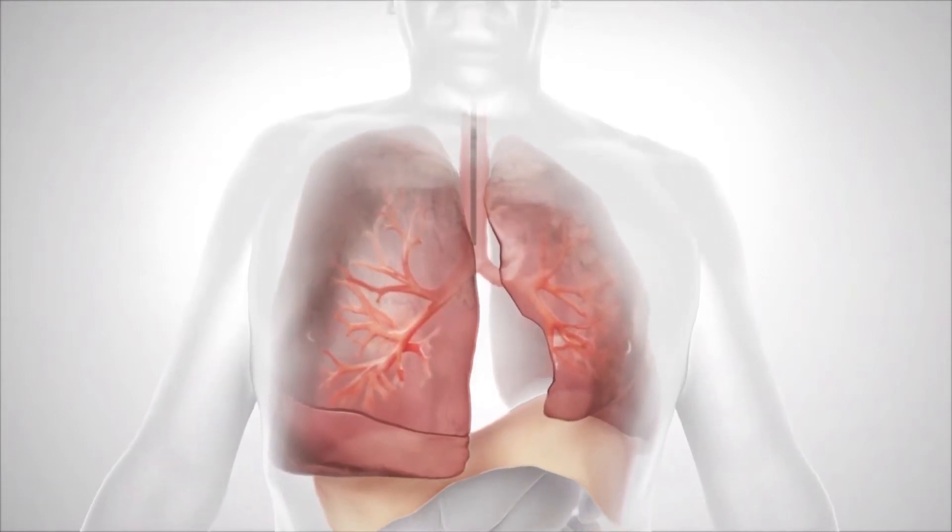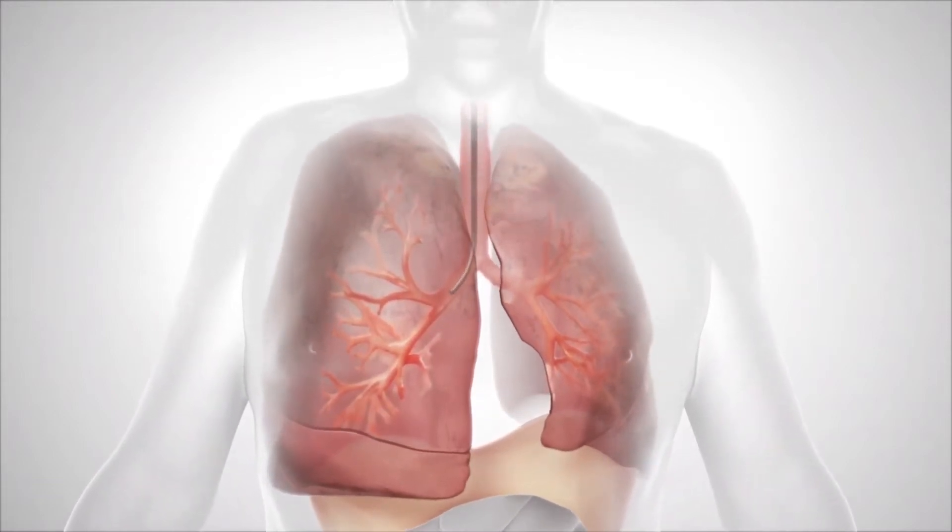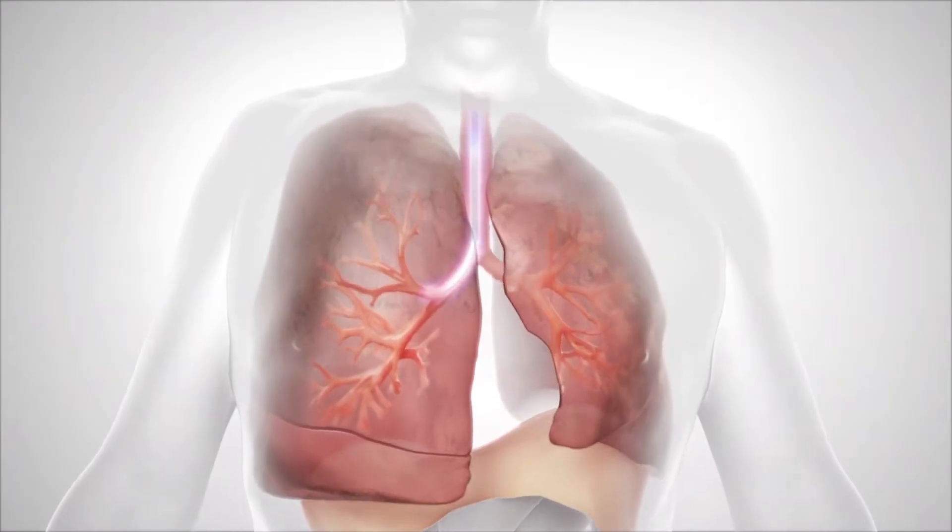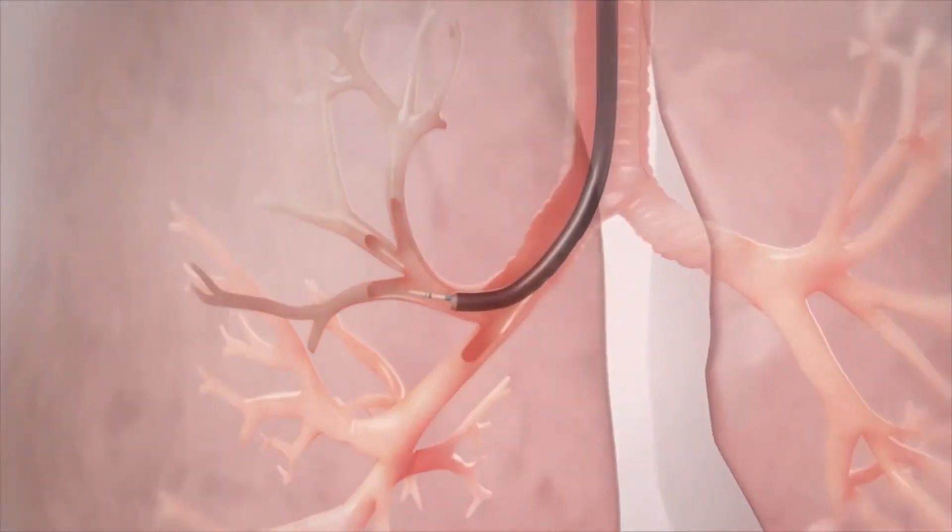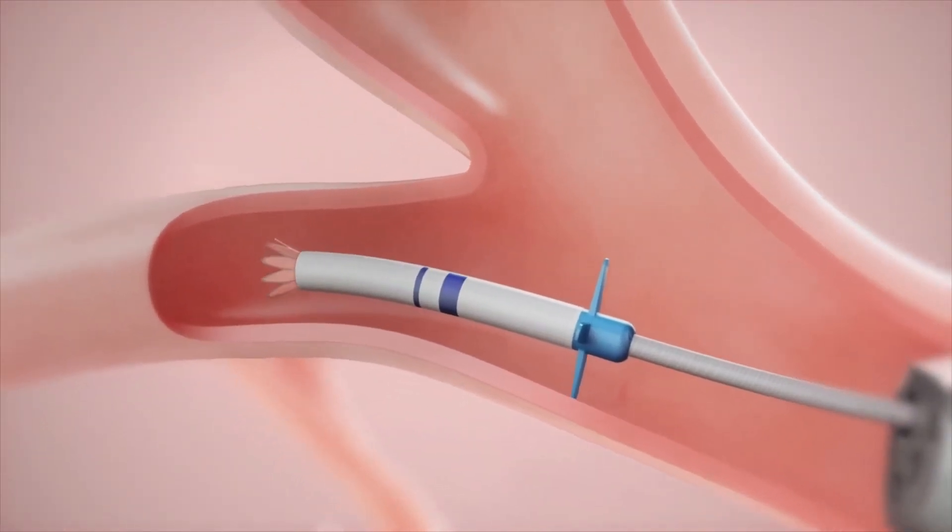The Zephyr valve procedure is performed under general anesthesia or conscious sedation, where a standard bronchoscope and flexible delivery catheter are used to guide the valves into the target lobe and desired airway.